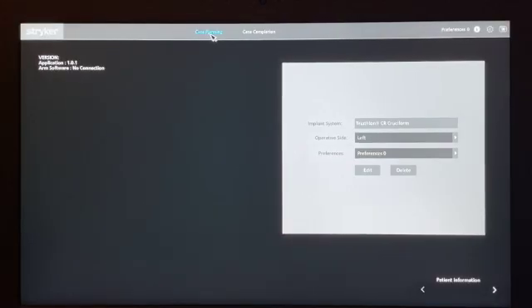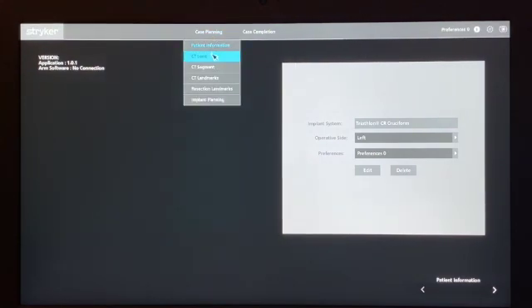Before starting any Mako case, it's important to check the patient's name and details, and check the side that you're operating on.